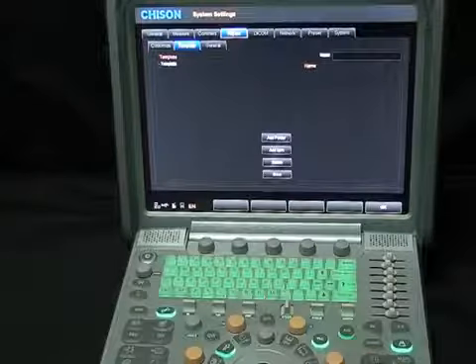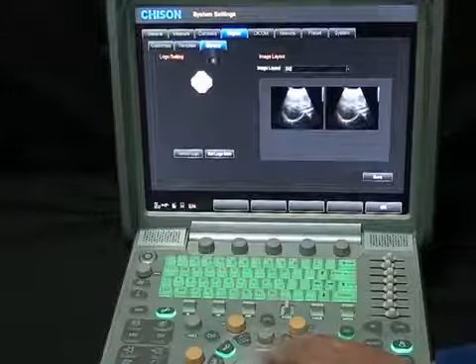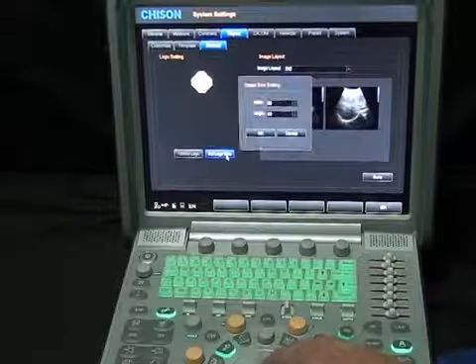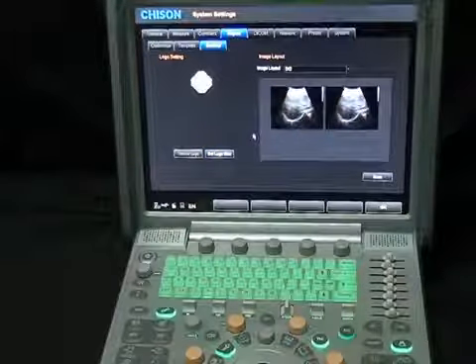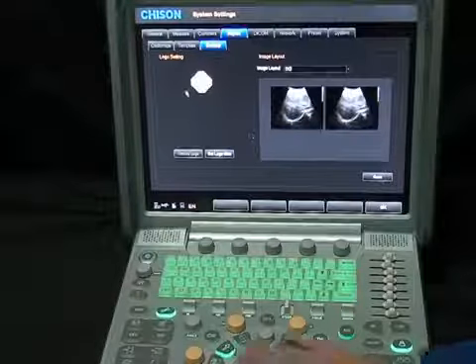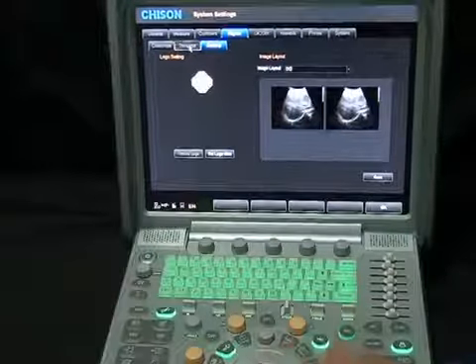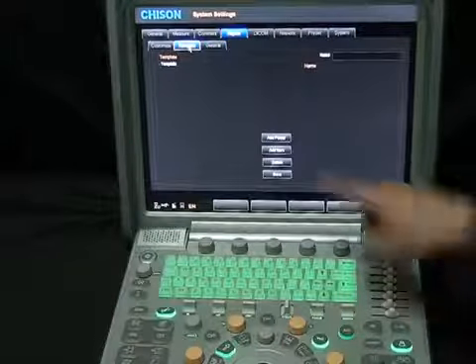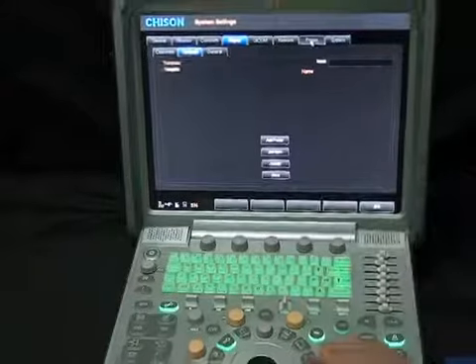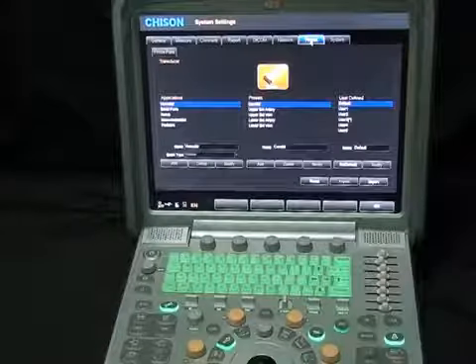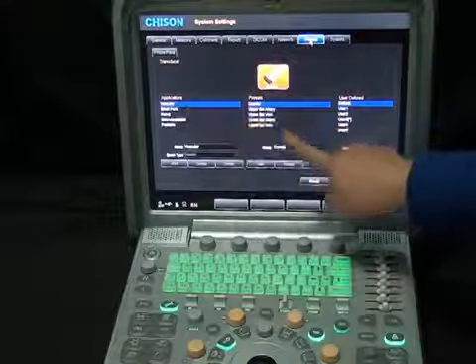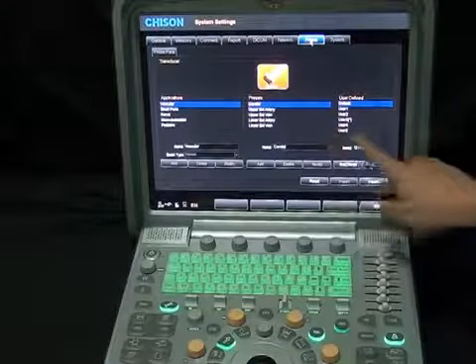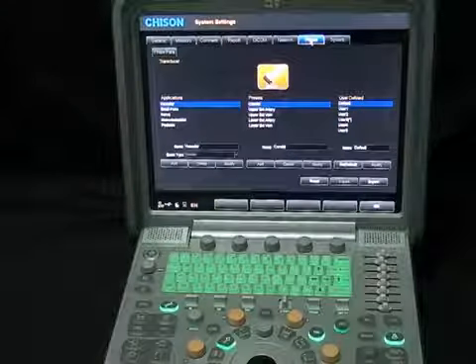What's more, in the report setting interface, you can set the hospital logo and layout to make your report more personalized. A report diagnosis template is also available, which will greatly benefit doctors' daily work. Unlimited user-defined presets are available in the preset interface, and users can add presets conveniently.